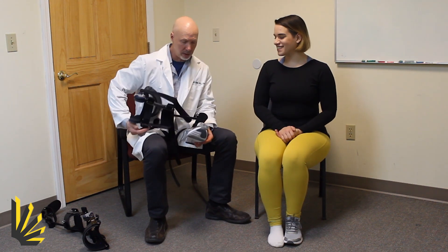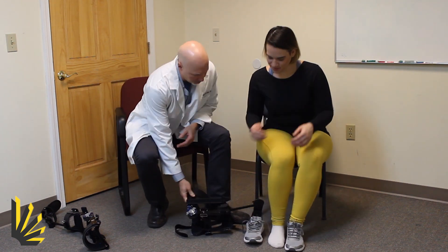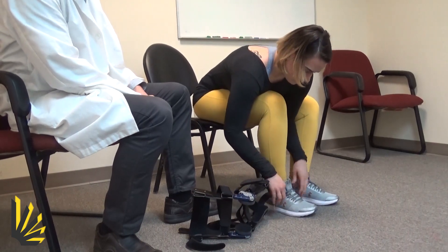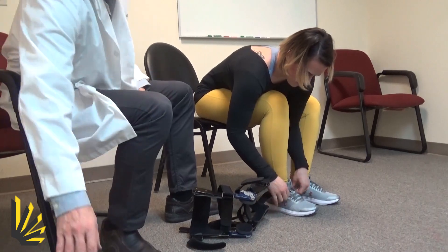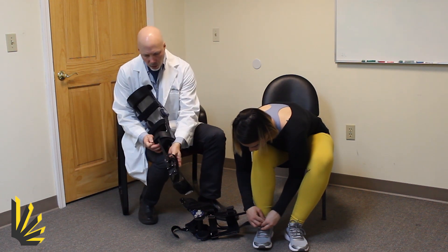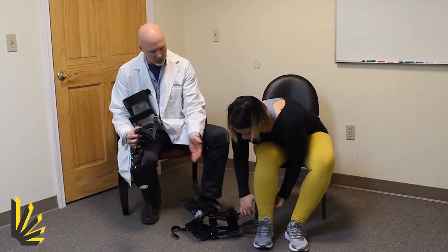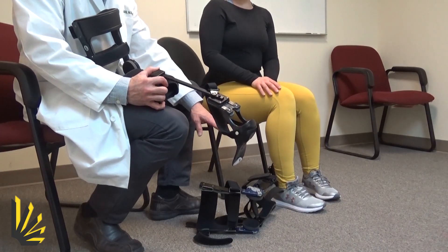This is Gwen. Gwen doesn't need a knee brace — thank you for helping us, Gwen — but she's here to demonstrate it for us. We're going to put that on there. You'll notice that the Mastid Knee Brace has a telescoping part, and right now it's set at the very top part of the telescoping, which allows her to put the shoe on without the brace getting in the way.